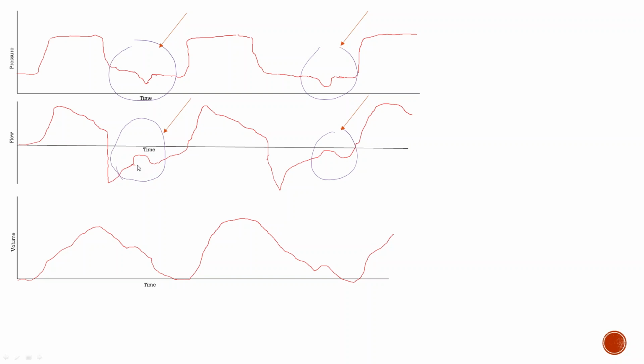Sometimes that gets kind of dangerous. People get scared of doing that because the patient might keep getting very tachypneic and then auto-peep even more. Or there's thought that you can just do early deep sedation and paralysis. But if you look at your patients more carefully, put your hand on the patient's chest while looking at the ventilator, sometimes you'll notice that this is actually present a lot. Once I learned this was the most common one, I started looking at the vents more frequently. And this is very, very common, more common than double stacking.